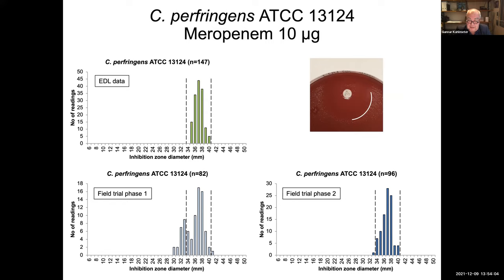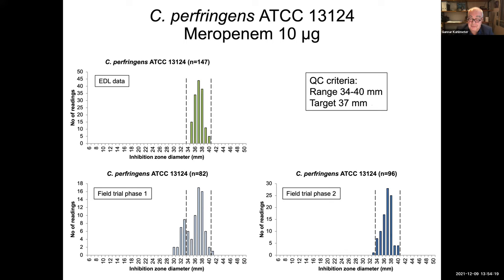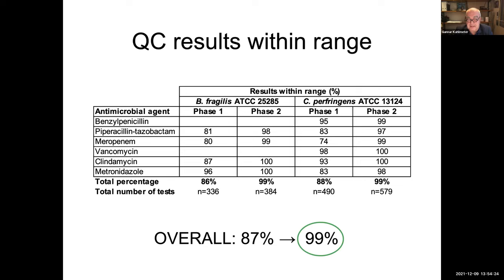So if 16 laboratories around Europe can get it right, and you saw several of these, and all of them speak the same language, namely that if you do what you're told to do, you can get it right. And I think that's a very important message, that it is possible to make this work, but you have to follow the recipe for how to make it work. And this is not one of those areas where you choose to express your personality. You will have to do that in dancing or singing or some other exercise.